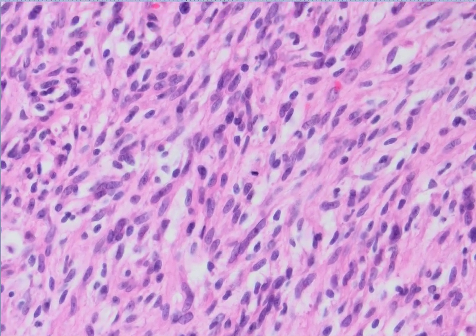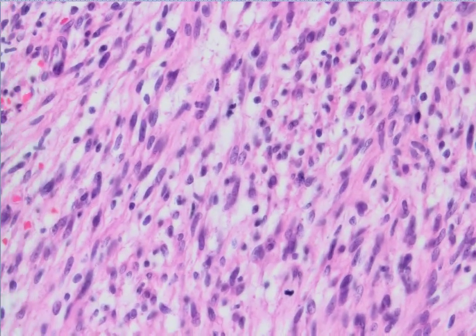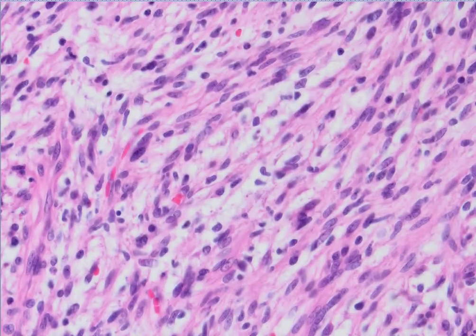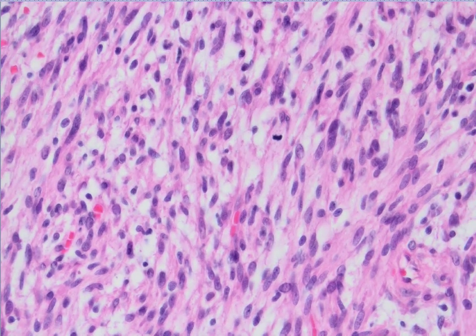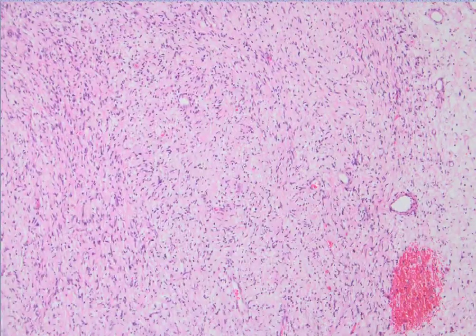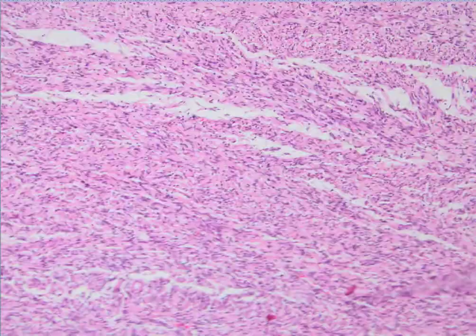Here there's a mitotic figure, and another one over there, but it's not easy to find. Yes, that is it. We see two mitoses, and in this case, we decided to call this atypical neurofibromatous neoplasm with unknown biological potential.